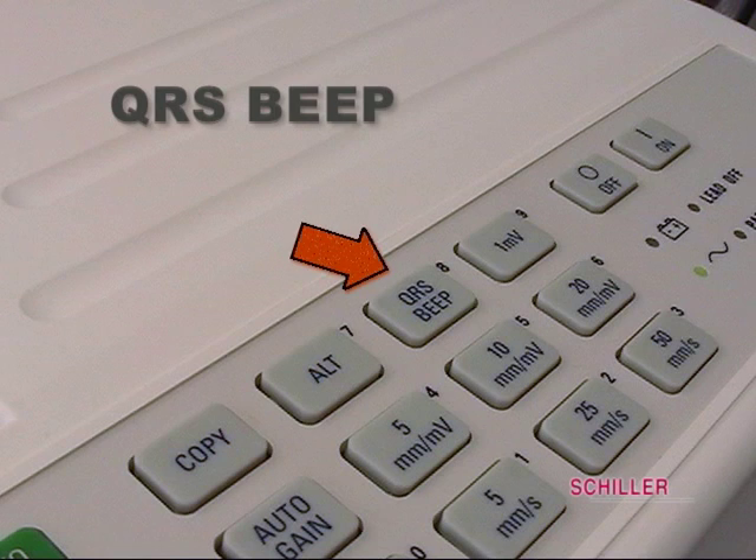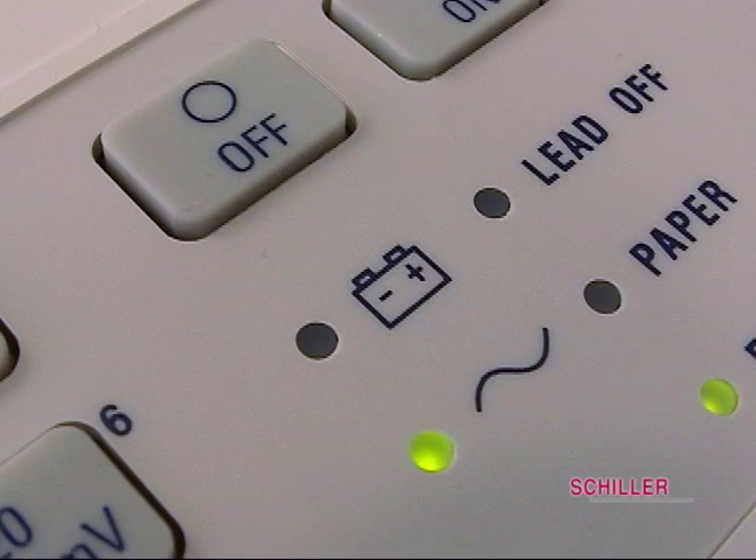QRS beep is for an audio beep for heart rate and QRS complex. One millivolt is used to send a calibrating signal. The LED light with a wave line is a main power indicator that the unit is on and getting power.